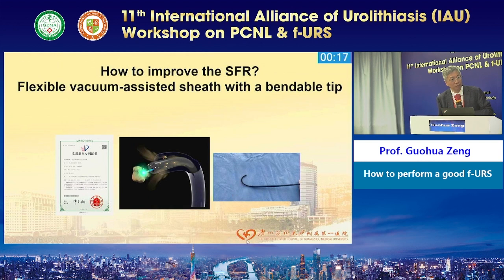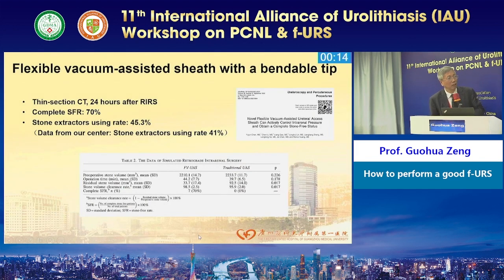Actually, you see, the complete stone-free rate is up to 70%. I think it's good. Sometimes you can use a basket, remove the lower pole stone to the upper pole pelvis, then you suction out. This is very important.